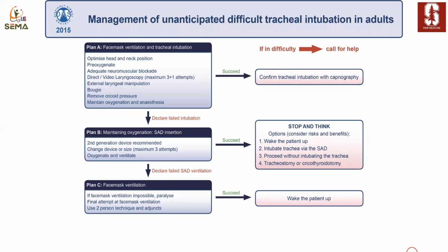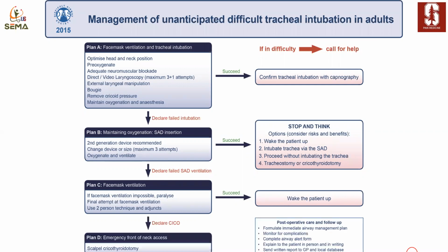So please hold the mask with 2 hands. Ask for assistance. There is no shame. Some patients are just difficult to face mask bag. So it's very important to move quickly on this procedure.